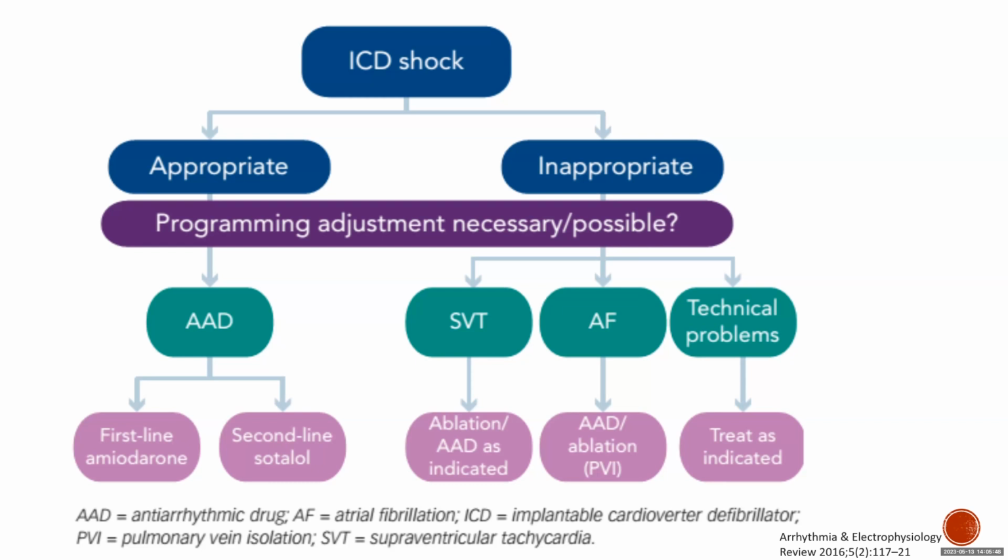But acutely, if you walk in the room and the patient is receiving shocks, you have the monitor. So when you put the magnet, you just manage the patient as if there is no ICD.